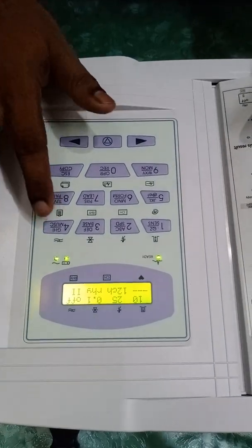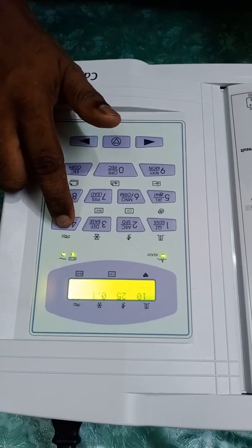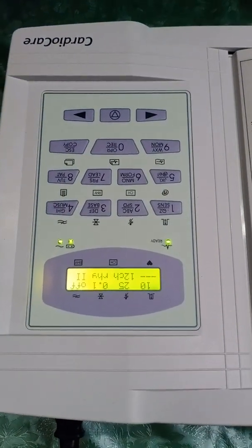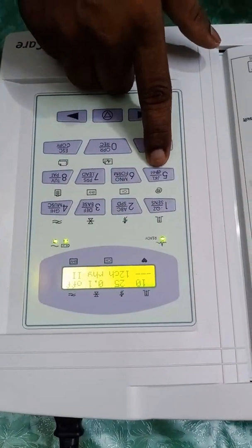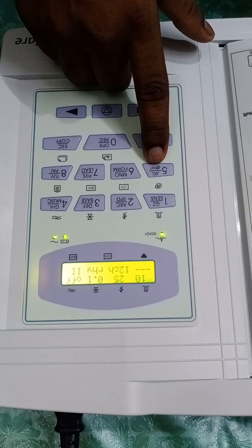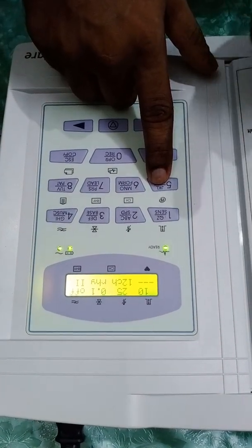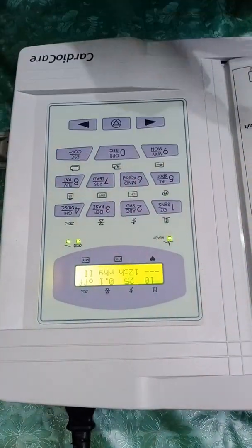This is the EMG filter. It is not that important because EMG can distort the ECG, so I am keeping it off. This next button, when you are connected to a LAN, will be used to export patient data. Since we have not connected anything to the LAN, I am leaving this option as is.